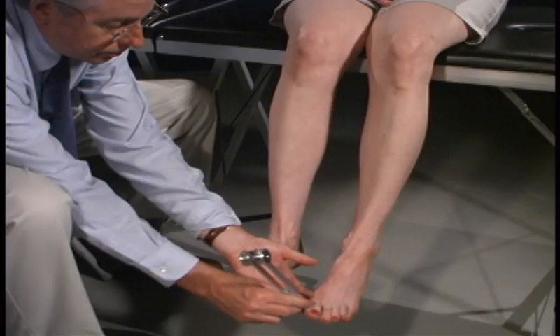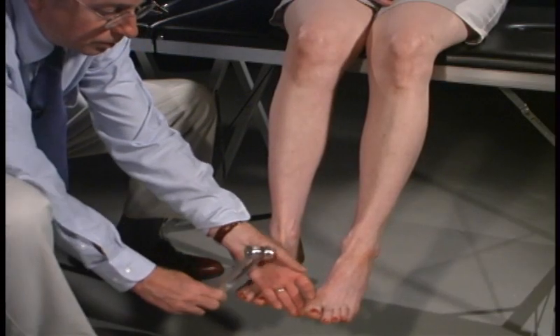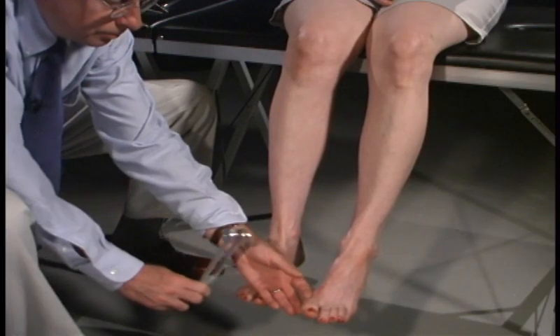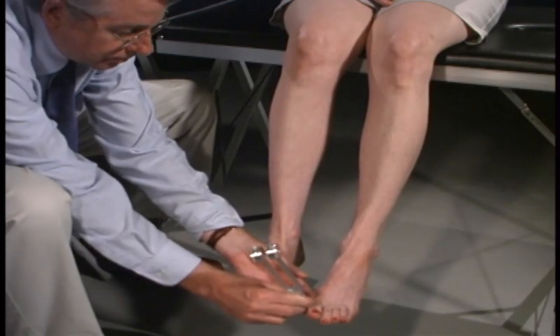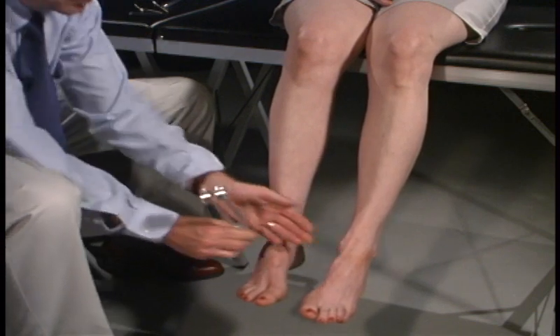How about over here? No. How about now? No. Yes. How about now? Yes. And can you feel it there? Yes. Good. Good.